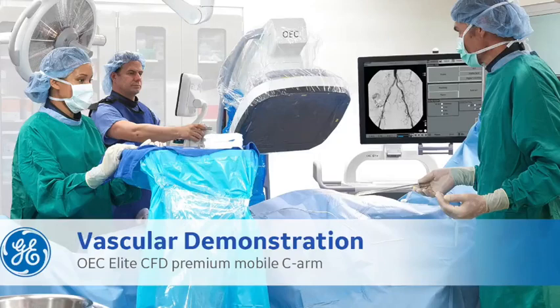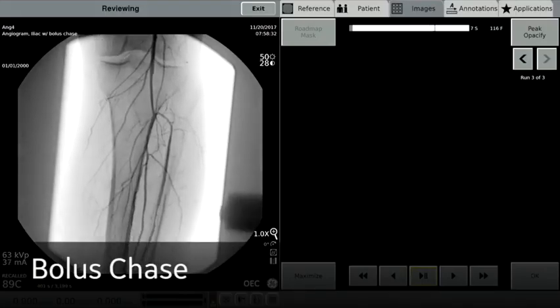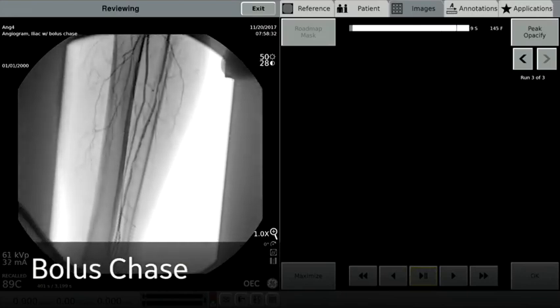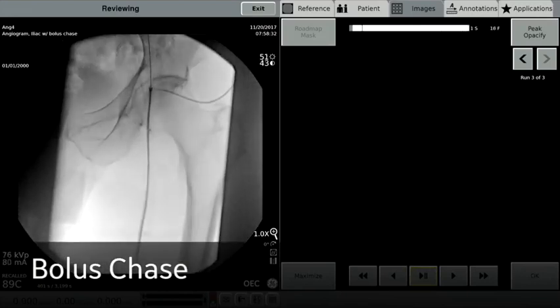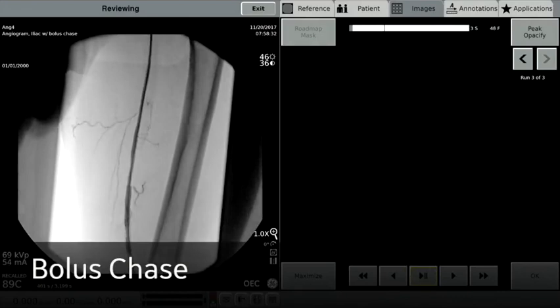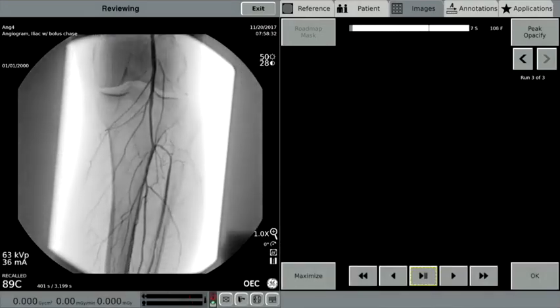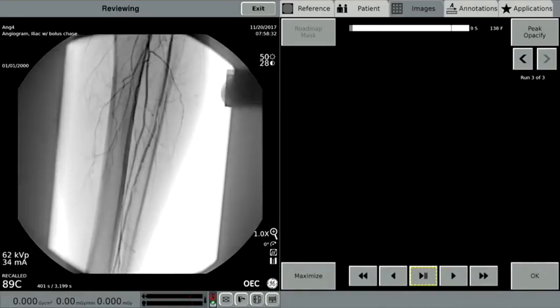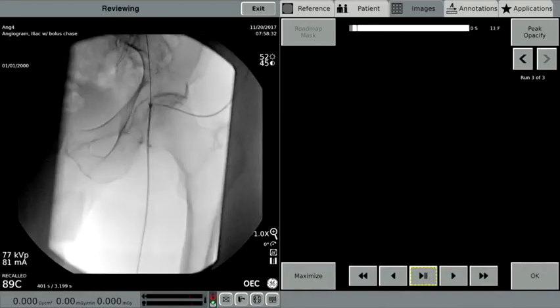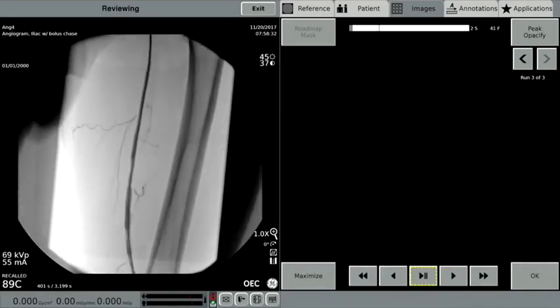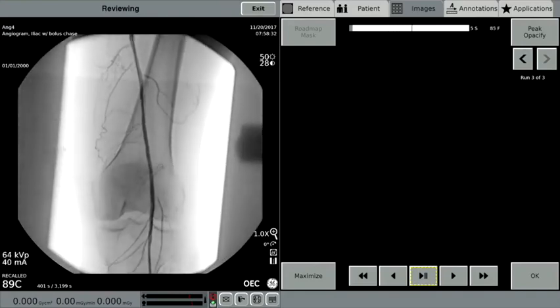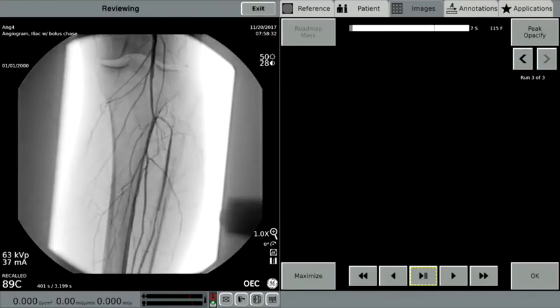This is a demonstration of the features available for vascular procedures on the OEC Elite CFD. The image displayed on the left is of a bolus chase completed on a patient. The OEC Elite CFD system is capable of producing very high detail of a vascular structure, even as the anatomy is moving relative to the OEC Elite CFD. In this cine run, the bolus chase profile is used with digital cine pulse.